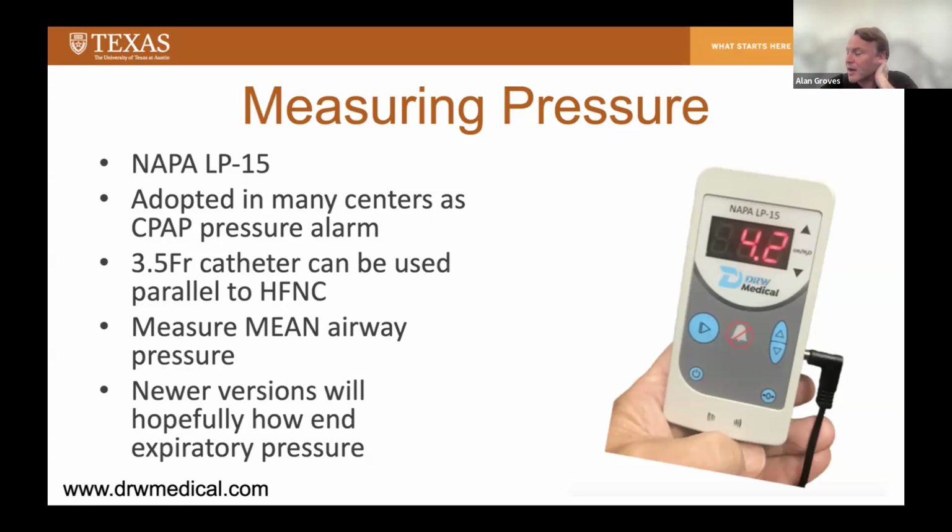I think DRW Medical have a newer version coming out. My one concern with this version is that it does measure mean airway pressure, and it's not telling us what the difference is between inspiration and expiration. And Kelsey, in just a minute, I think is going to give you a really compelling demonstration that we really need to think about that whenever our babies are on high flow prong setups.